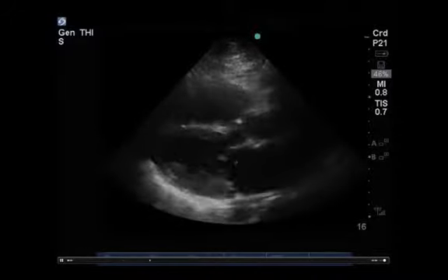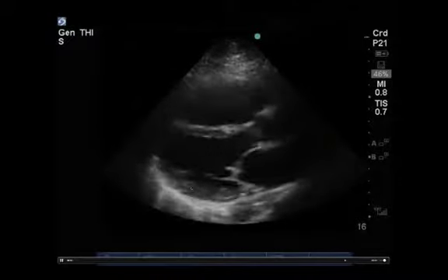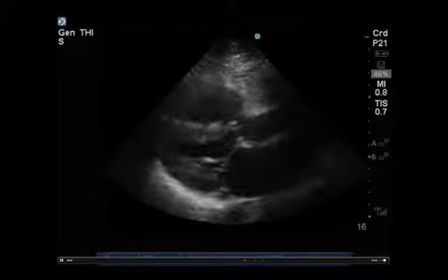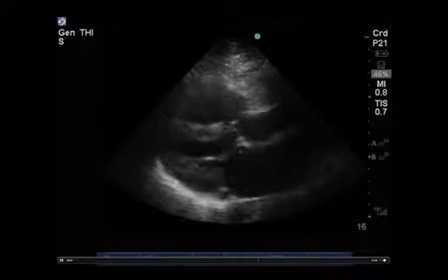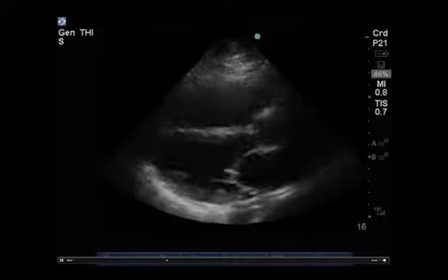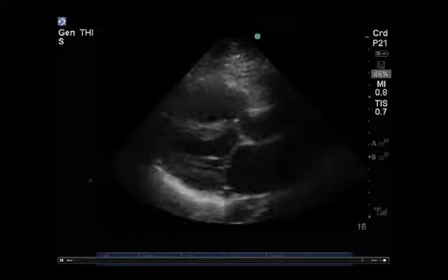Then looking at the mitral valve, however, we see a distinctly different geometry and morphology compared to our previous normal example. We see some degree of thickening at the distal tips of the leaflets, and we see a distinct pattern of restricted opening and a somewhat crooked geometry during diastole, also referred to as diastolic doming, which is highly suggestive of mitral stenosis.